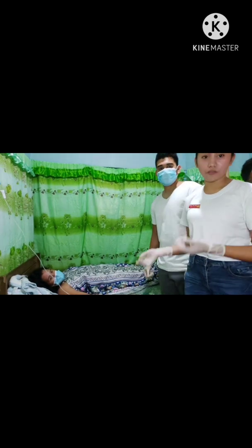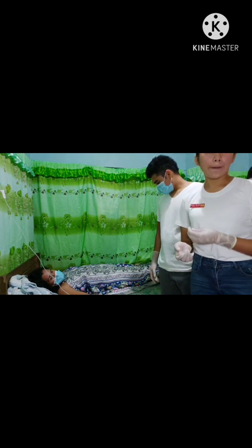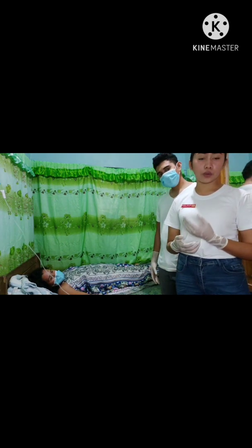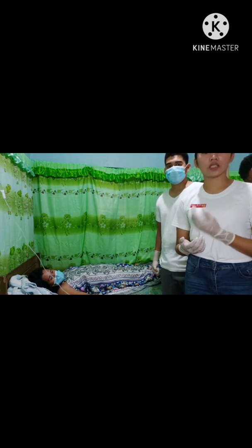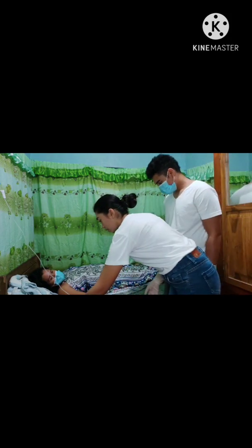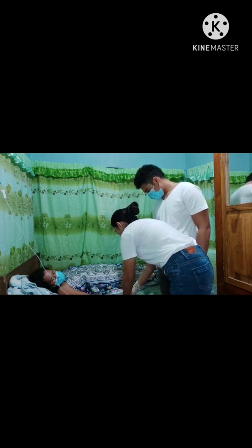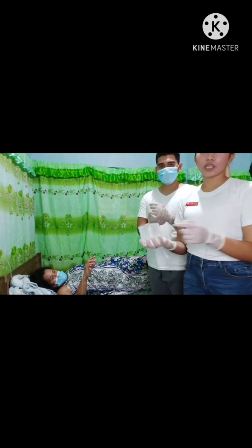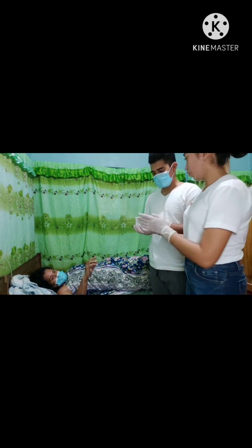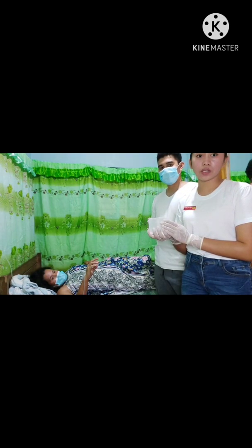So we should secure the IV cannula by putting additional tape and adjust the flow rate according to the doctor's order. So if it's 30 drops per minute, we should adjust it to 30 drops per minute. Put it here in the butterfly. So after the doctor has removed the needle, we should get the sharps bottle, put the needle there and then dispose of it. Do not throw it anywhere, to avoid needle prick.